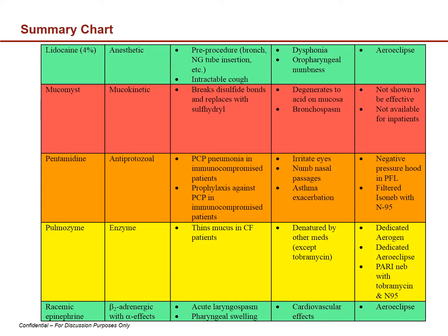Appendix A of the procedure on the portal gives an alphabetical and color-coded listing of commonly nebulized medications. Those color-coded in green are available at SHC and carry minimal risk associated with administration. Those listed on a yellow background are also available at SHC, but require special equipment or procedures.